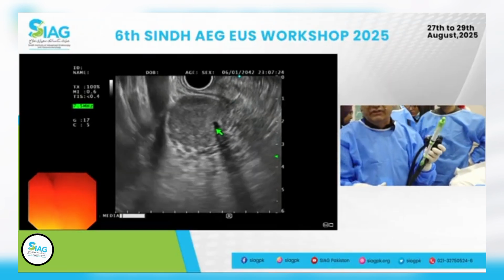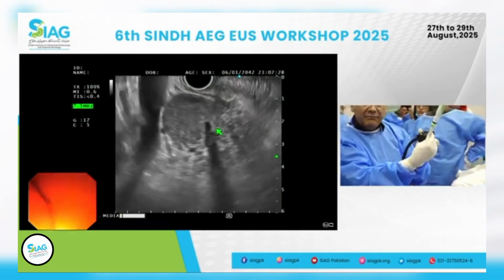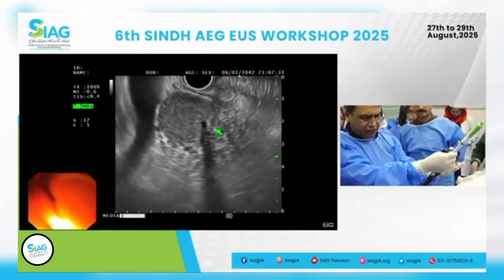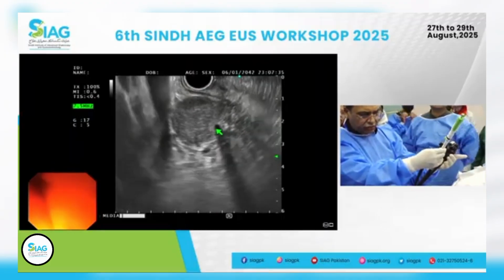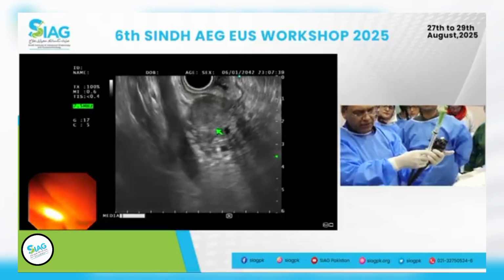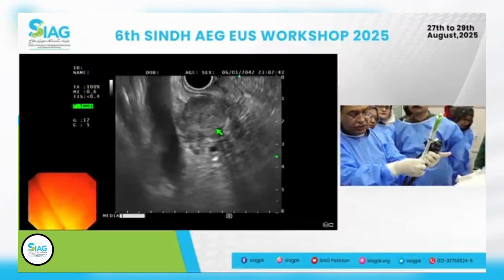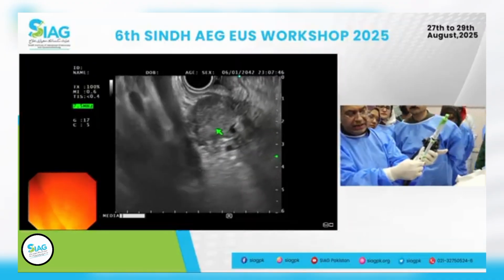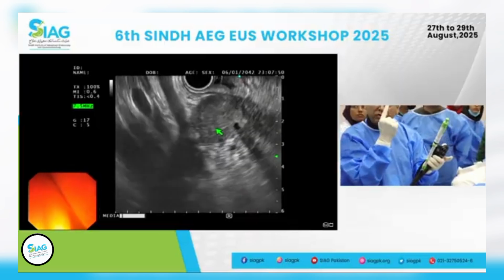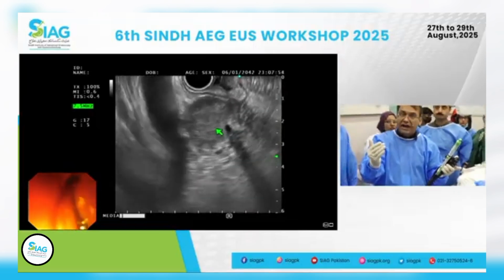The way you avoid that, in pretty much every needle, to some extent, is when you put the needle onto the scope, it's nicely rested on the scope, with the wheels facing towards you, and then you lock the needle onto the channel, it makes a 3/4 turn, and the wheels come to the right side.